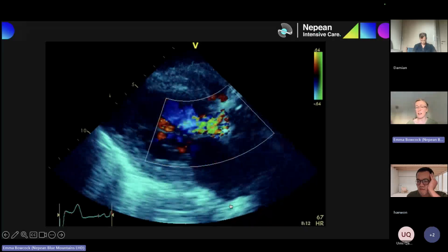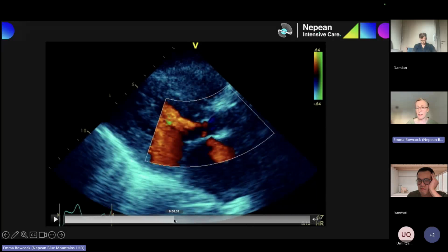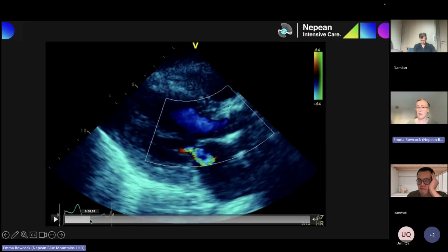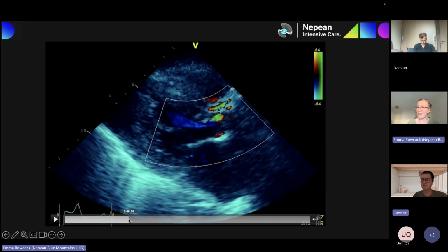I think you did well with describing that. There's a little bit of MR, and I think it's actually systolic MR rather than diastolic, but you could slow that down and say, I just want to check that there isn't any diastolic MR there. That would be quite a nice thing to say, wouldn't it?